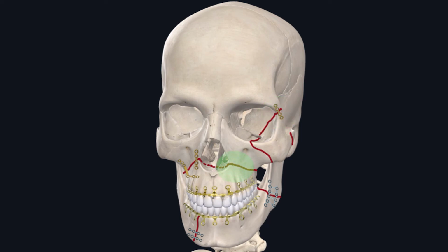Next, I'll jump down to the medial buttress of the Le Fort 1 along the left piriform aperture, as there's a higher probability of this particular bone segment being intact, while the lateral buttress on the left will most likely be more comminuted with poor visual cues for bony reduction. And once I have surrounding fractures reduced, I'll then focus on the lateral buttress, as this will most likely be the most unstable fracture segment with adjacent Le Fort and ZMC fracture.